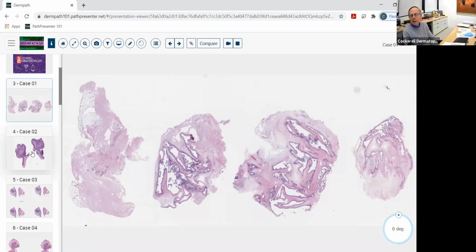So I don't want you to think you need to become a dermatopathologist or an expert and learn about all these arcane and bizarre names. I'm going to try to give you just some general pearls that you can remember. And then hopefully when you face these on a board examination, they'll seem like just pretty simple things to diagnose.